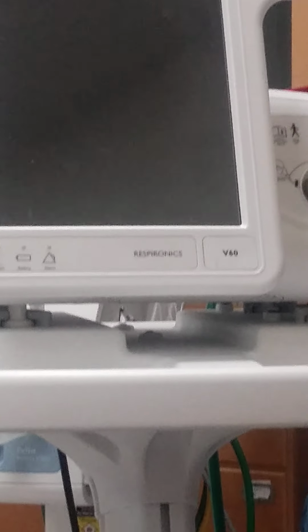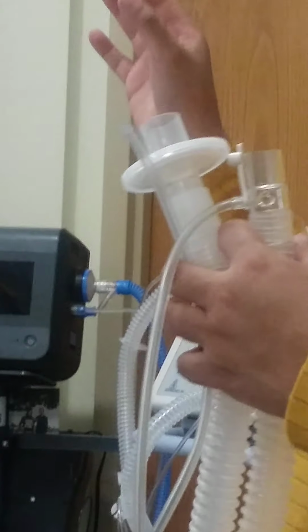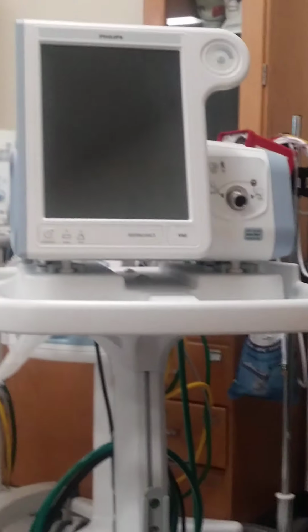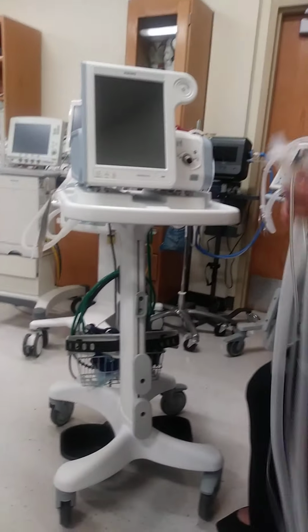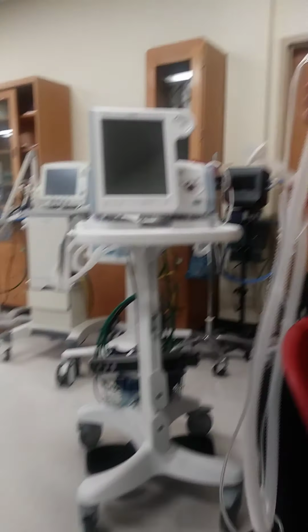Okay. Now this circuit has it automatically on here. There's some circuits who they come without it. So you actually have to go to your department's equipment room and find one to put it on here. Okay? Now this machine is really nice because when you calibrate it, it tells you, does your circuit have an exhalation port? And the old one, this is the old one that I was using, it doesn't tell you that. So it's kind of dummy proof, right?